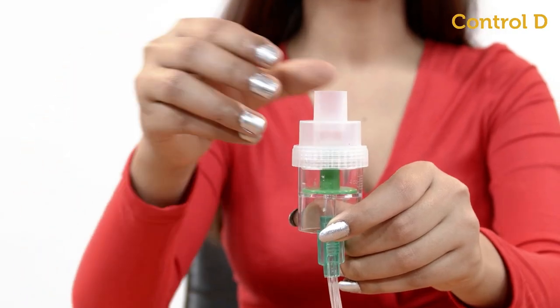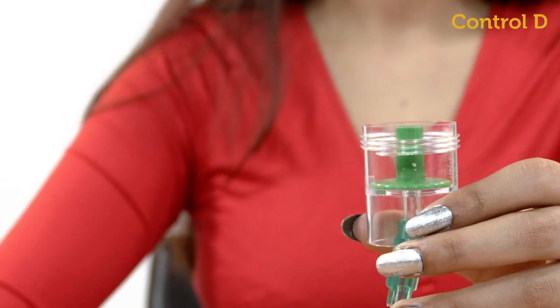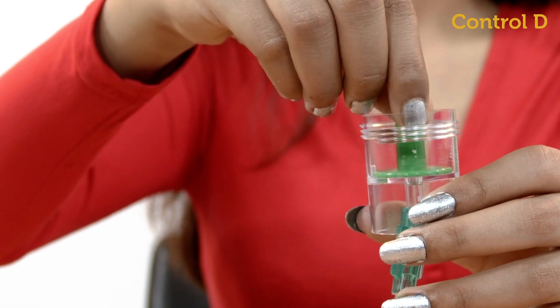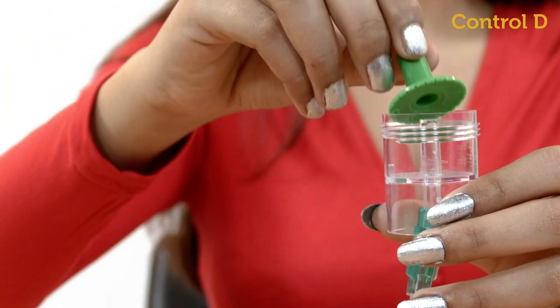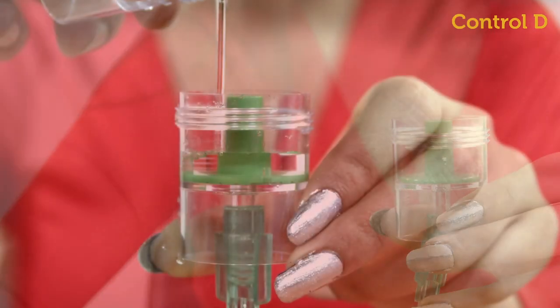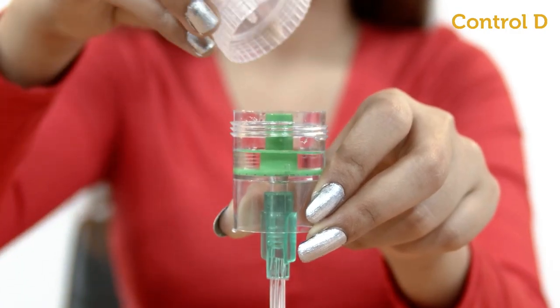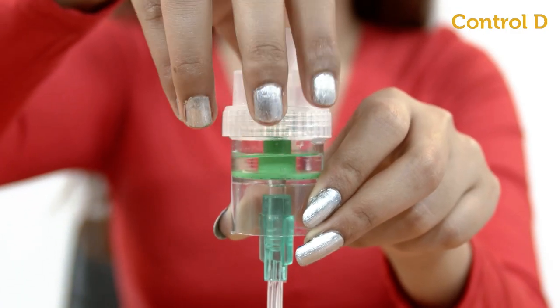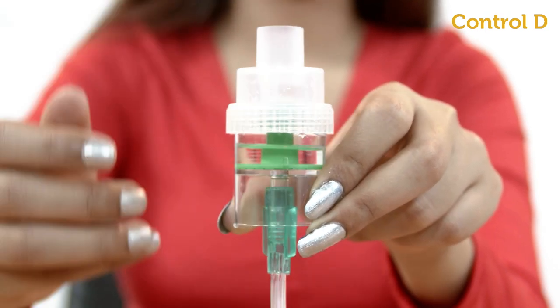With clean hands, twist and open the lid of medicine chamber. Make sure the green cap is in the place, as it is important for the mist formation. Fill the prescribed medication and close the lid of medicine chamber. The chamber can hold up to 6 ml of medication.